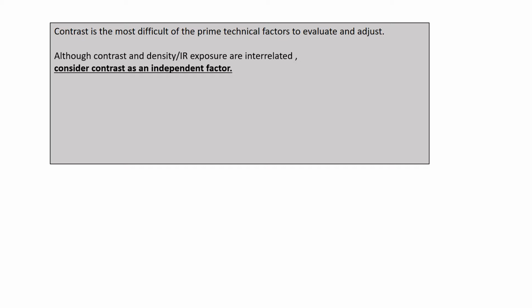Of course, you have to have differences in densities to create contrast, but when we think about what we learned for density and now we're learning about contrast, sometimes it may seem that they can come into conflict.